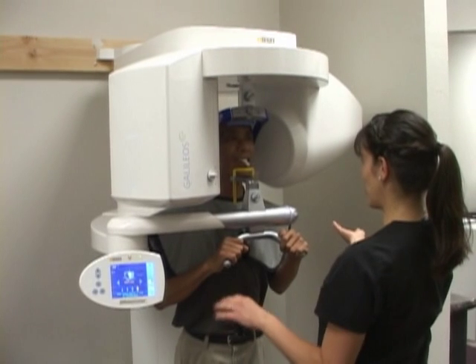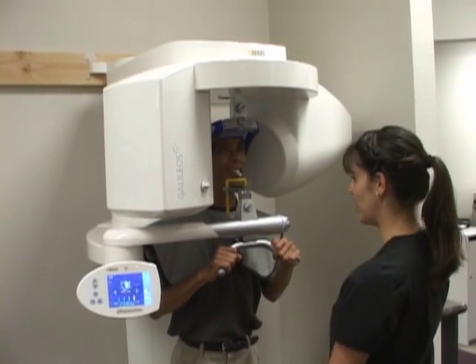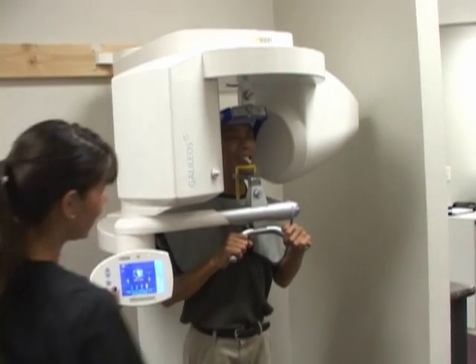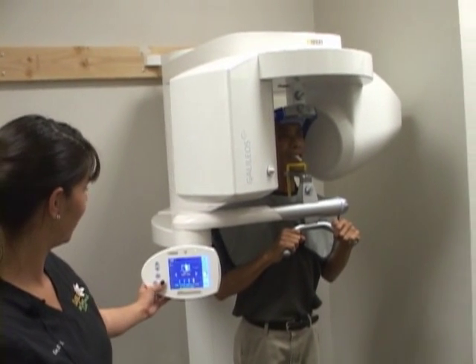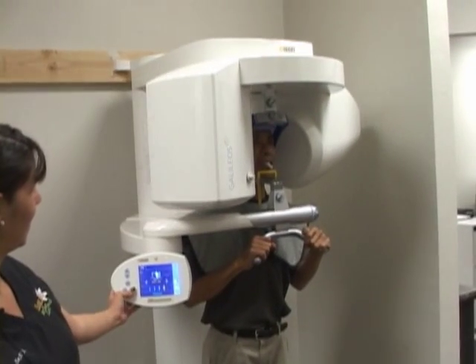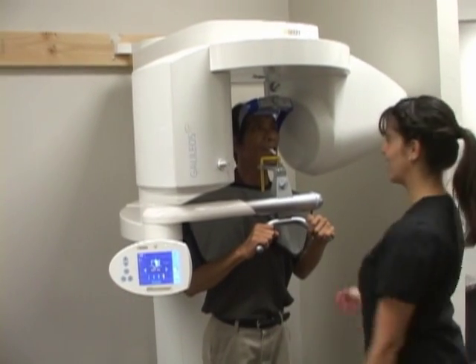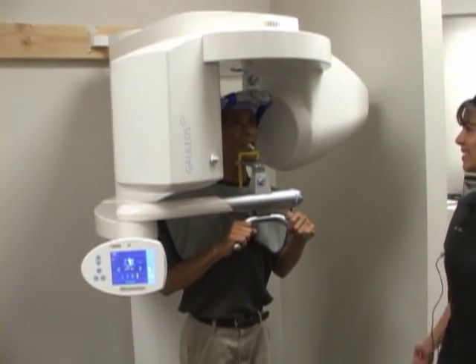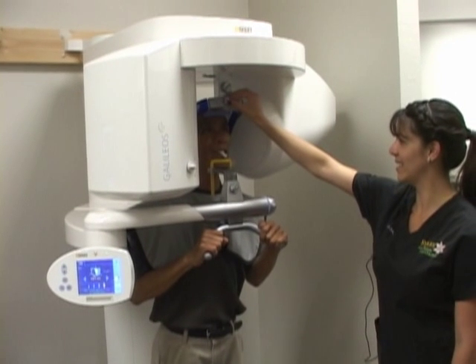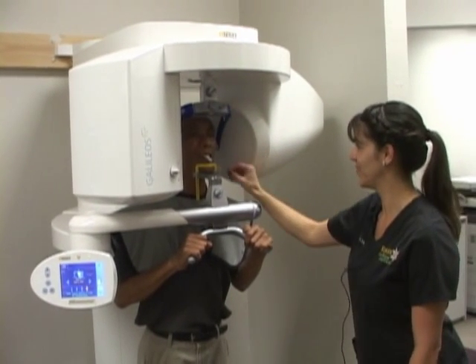This machine is just going to rotate around your head for about 15 to 20 seconds to be as still as possible. And that is how we get our detailed dental imaging.